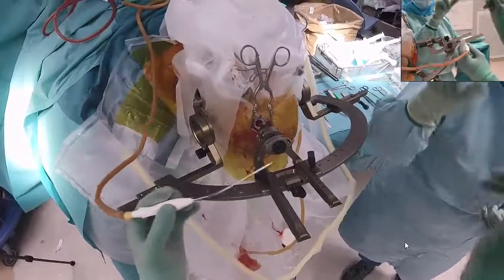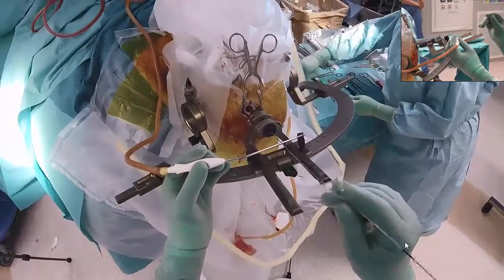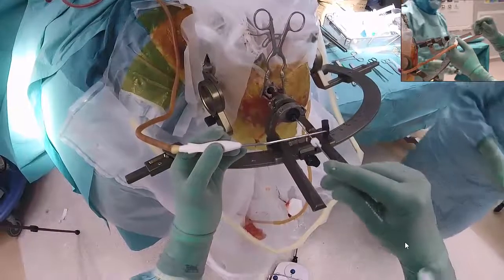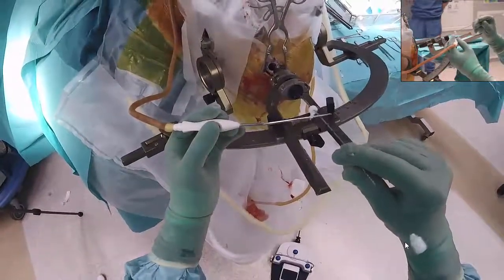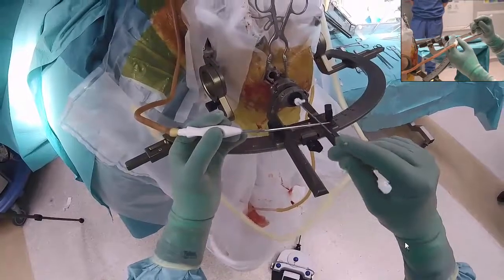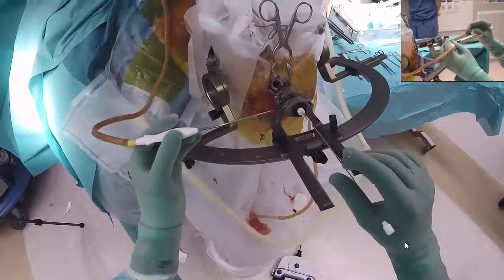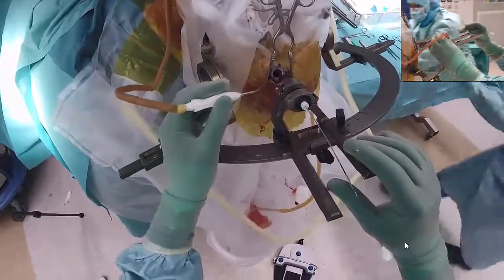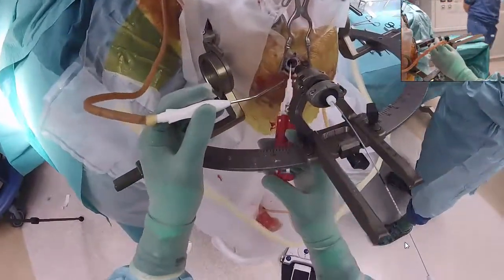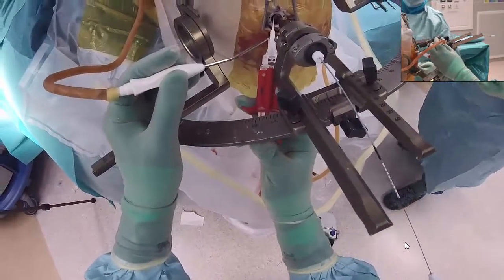It is then time to implant the electrode. I first make a channel with a radiofrequency electrode and then introduce the DBS electrode into this. The only difference when implanting the Abbott electrode is that it is probably best to keep the directional marker in the intended position during insertion in order to avoid torque. When the electrode is in place, I seal the durotomy with tissue glue.